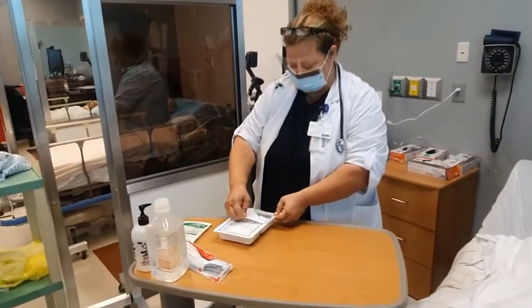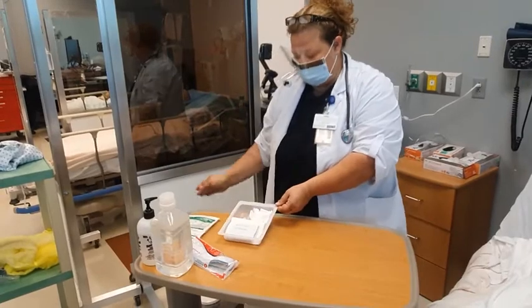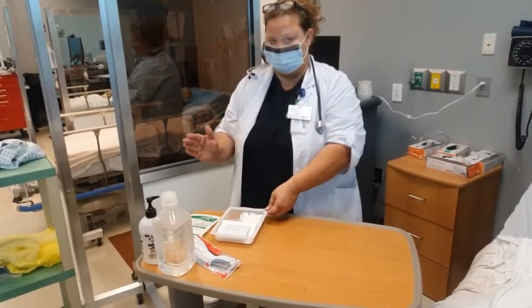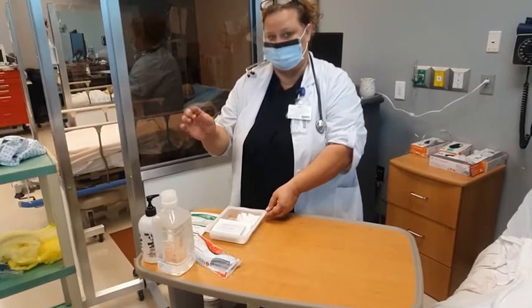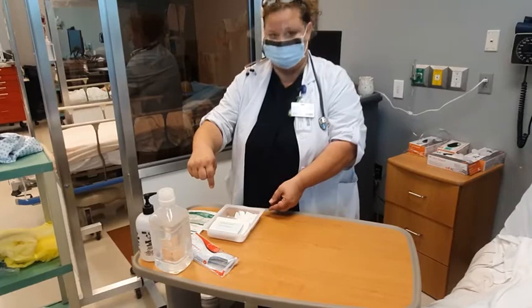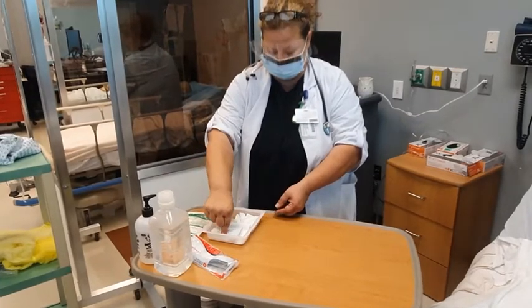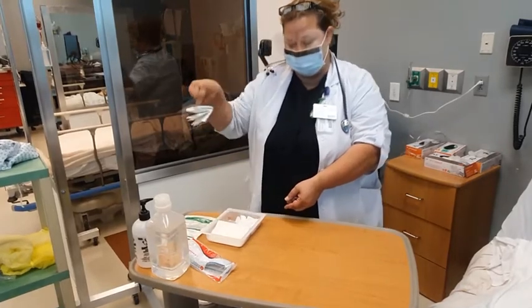Just remember when you're opening up the kit to pull it away from you and not to contaminate. You'll have the kit either to your far right or your far left. You'll have room to put the drape. Now the kit's going to have gloves inside of it, which you can use. But if you're not wanting to, you have to pinch the outside of it, not to touch anything inside the kit, and dispose of.